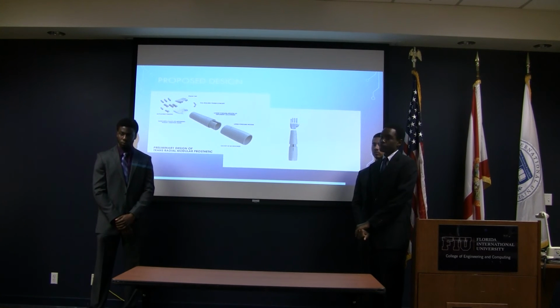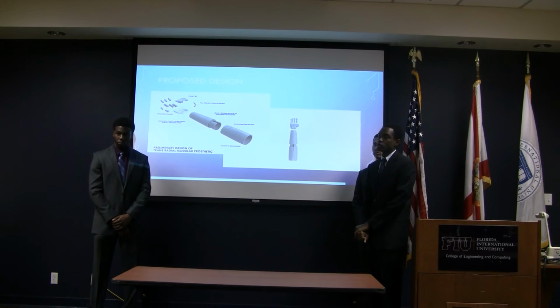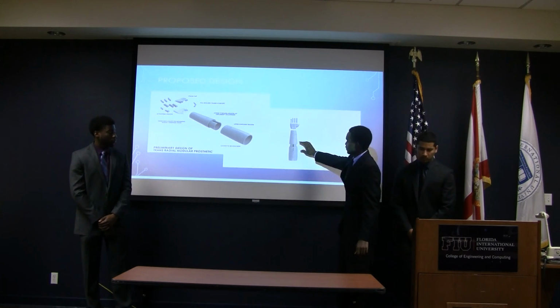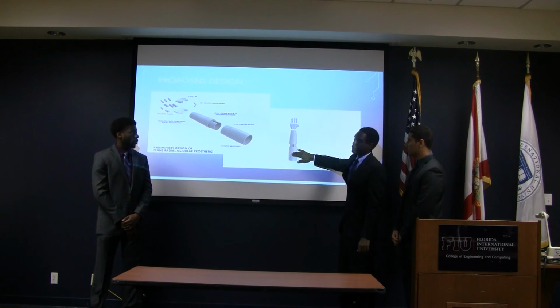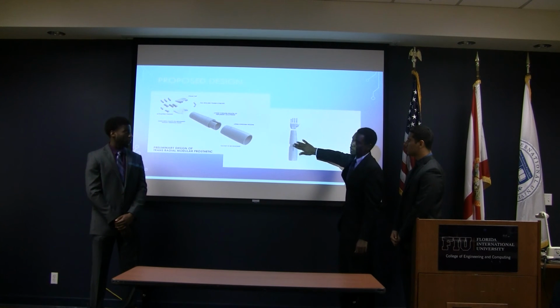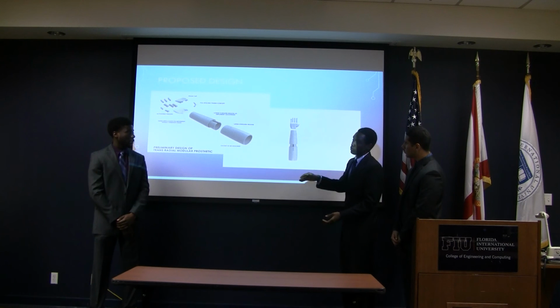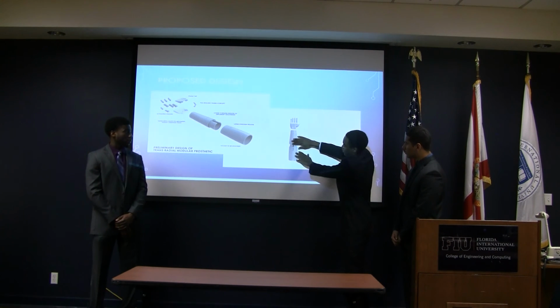And the part that would grab your arm, add a piece in the middle. Is that the concept? Yeah, so the concept is pretty much, this piece right here, we plan on layering with the appropriate material to pretty much block this cavity. But what happens is that as the child grows between those two stages, between 5 and 8 years old, this part will be able to adjust.